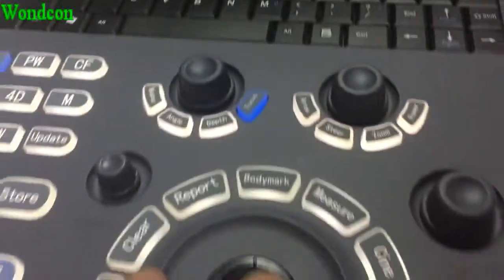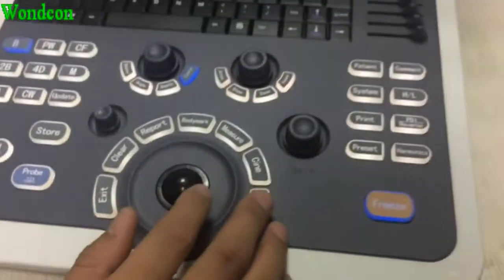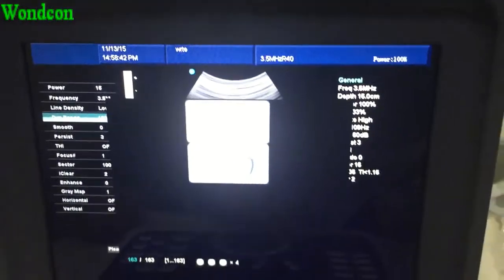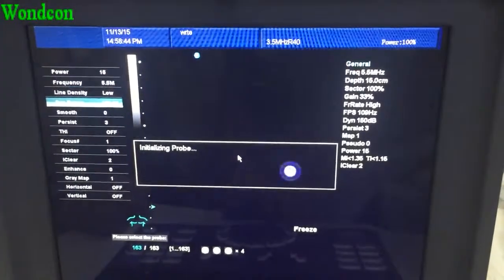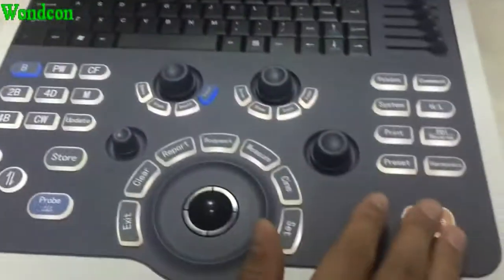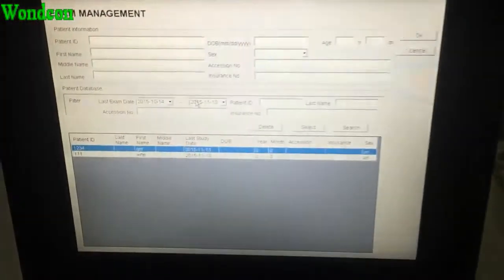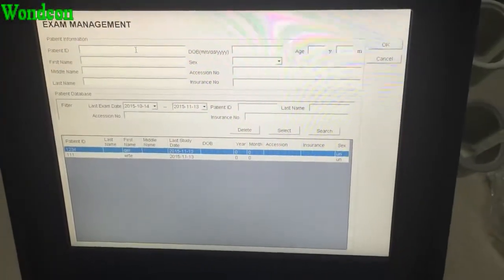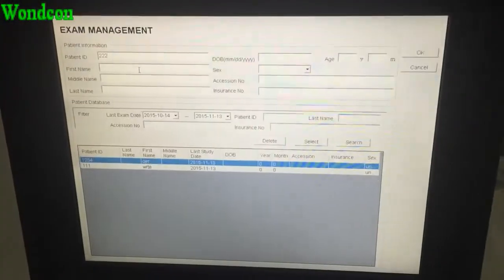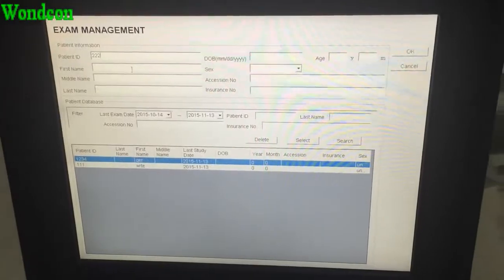When power on the machine, firstly choose probe, then phrase and choose patient, input patient ID and first name.